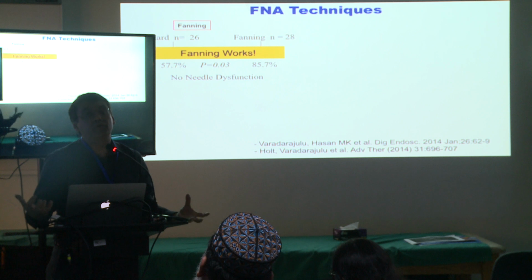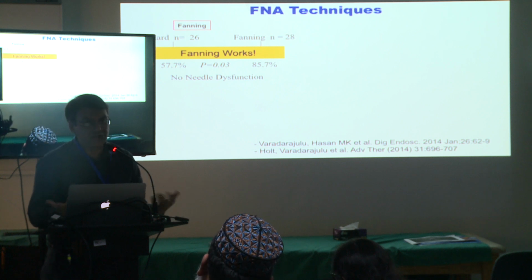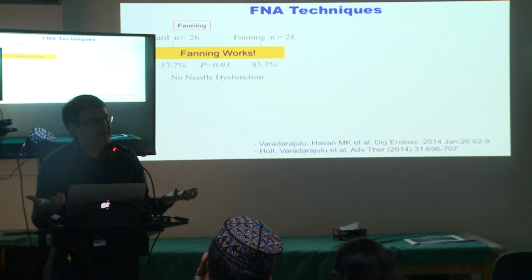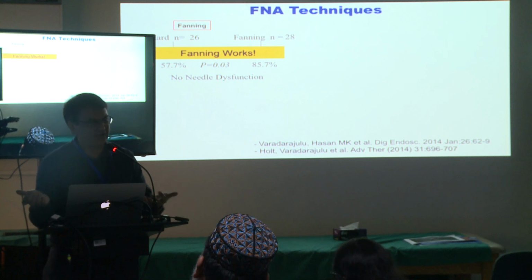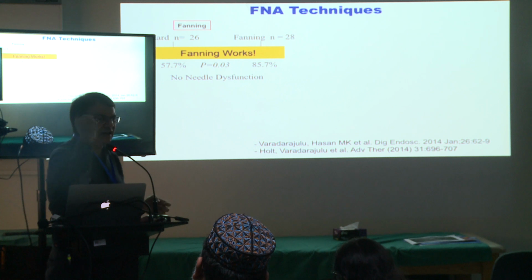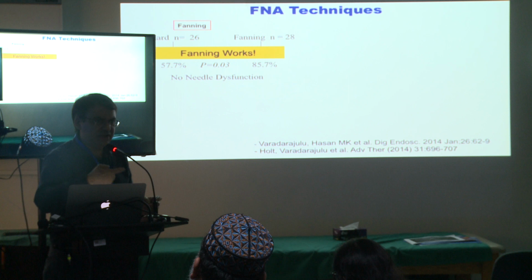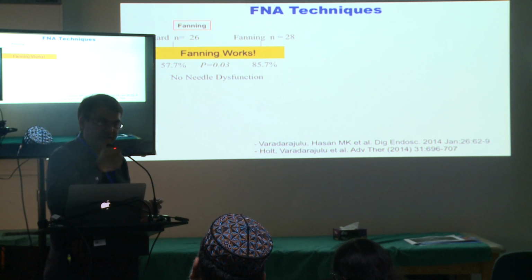As a last resort, you can use the elevator too. And I do that, whatever works. It's not that difficult, even with the elevator. As long as the needle is out of the scope beyond the elevator, you're not going to have a problem. But the needle may bend in there.